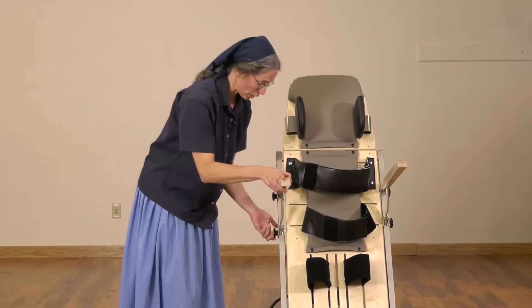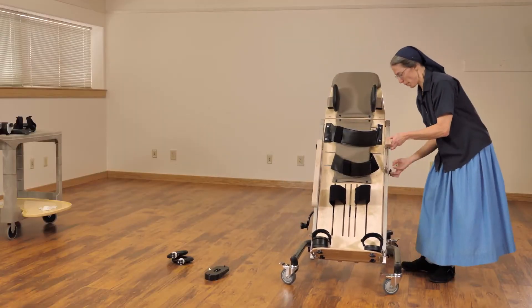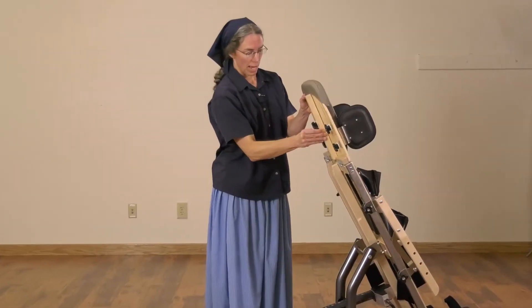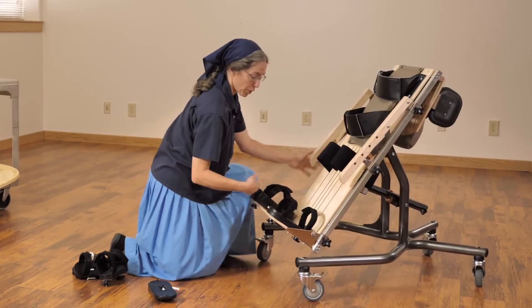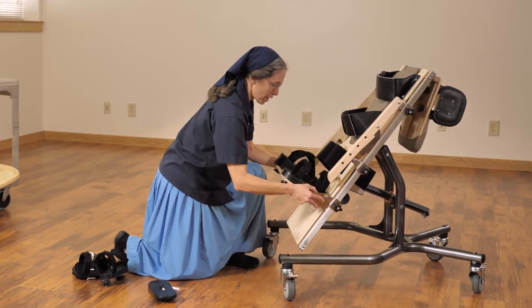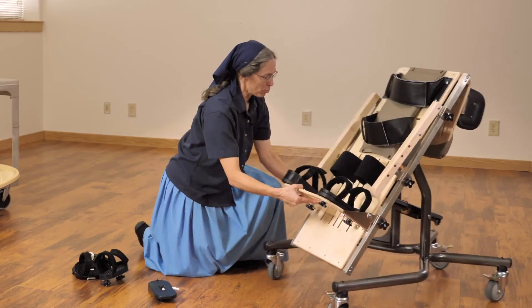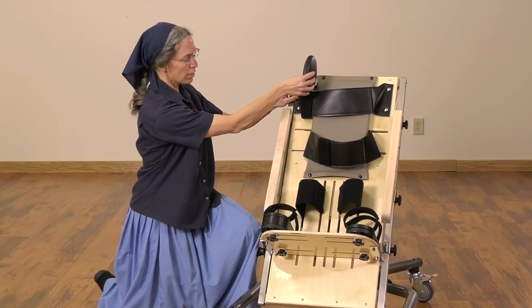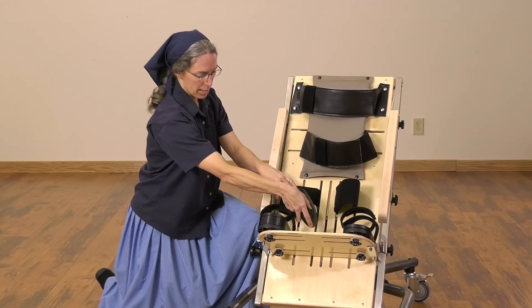For a smaller child or a child who no longer needs the head support, it is possible to simply adjust this bar and drop it out of the way, then raise the footboard up. You'll notice immediately that we are now accommodating a much smaller child. These same round laterals can now become head supports if needed, or be used for the trunk or even between the legs as indicated.